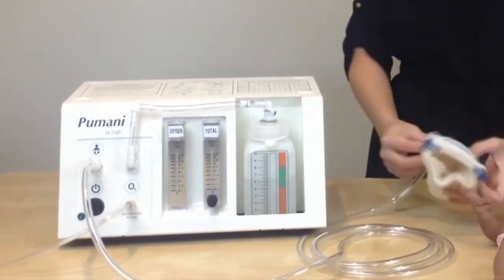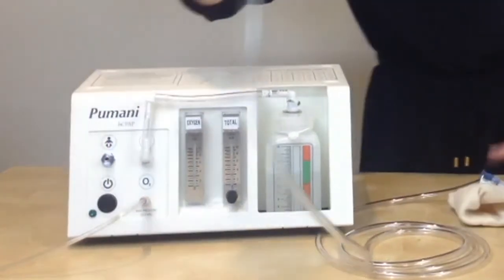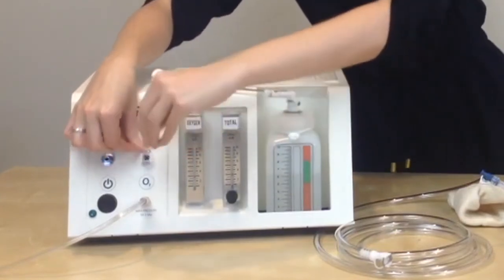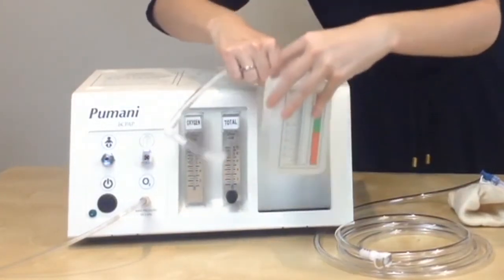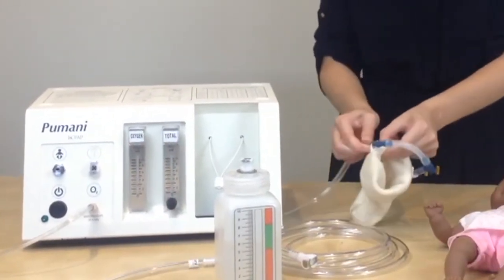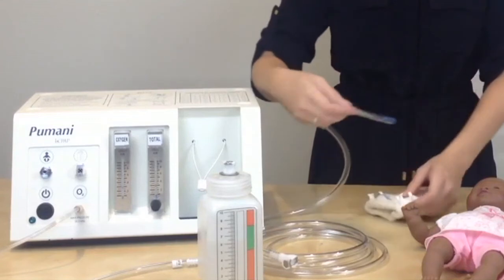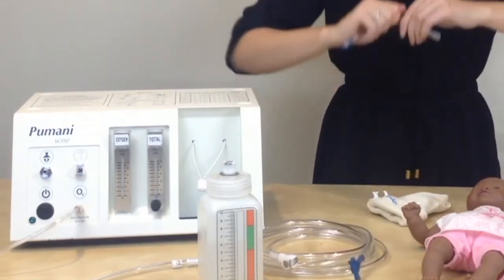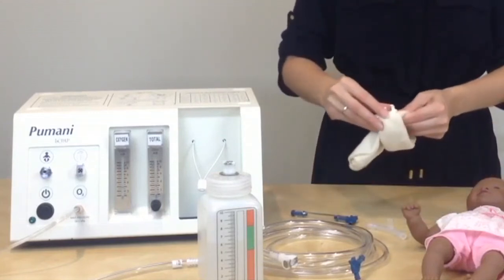Then you will take apart the tubing — attach the patient tubing, attach the bottle tubing in the bottle, and then you will take apart the nasal prongs and the end cap, and remove the hat clips from the hat.